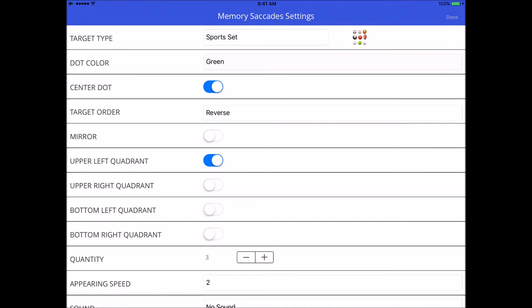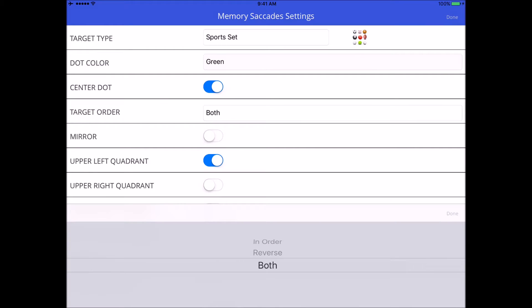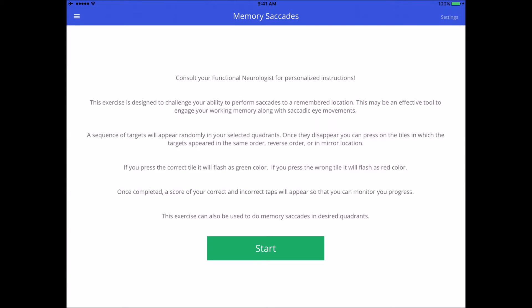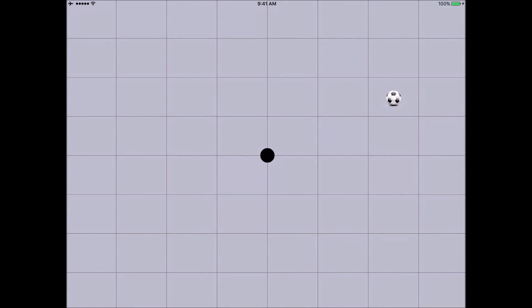You can make this harder using the mirror option. Let's do 'both' order so you can see what that's like. I'll make my saccades in the upper quadrants — the upper field tends to activate the temporal lobes more, and the lower field is more parietal. Here we go: target one, back to center, two, back to center, three, back to center. Now doing it in order first, and then in reverse order — six out of six.